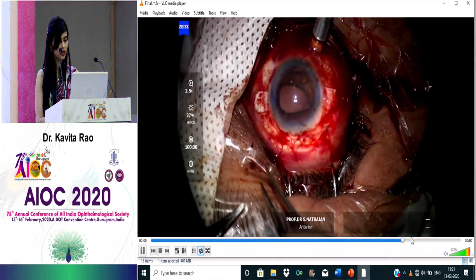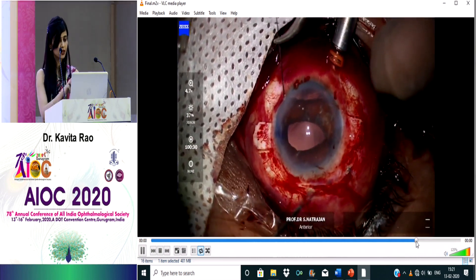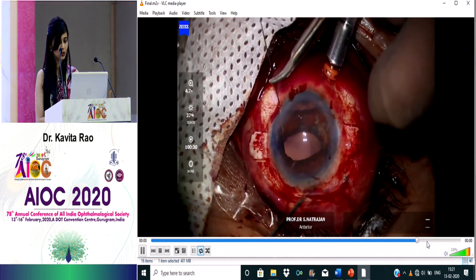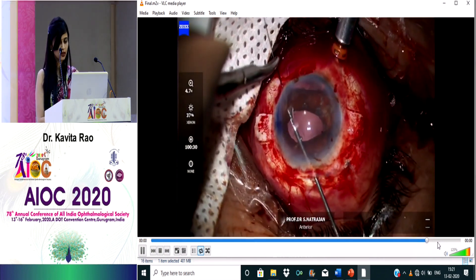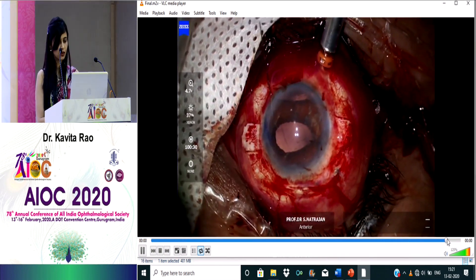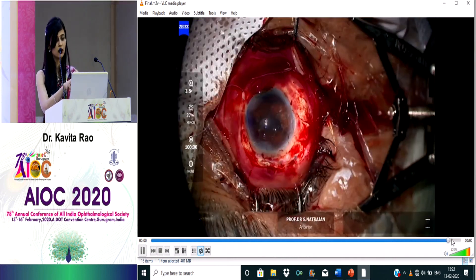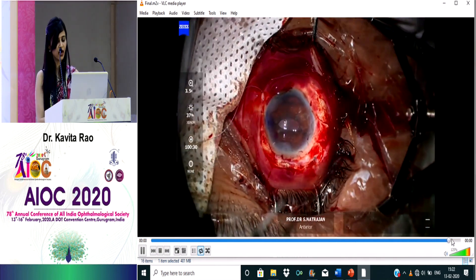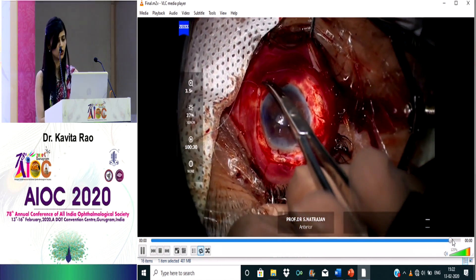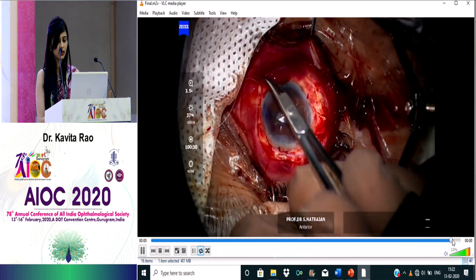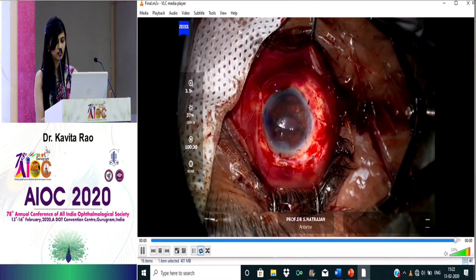The same is repeated on the other side. You can see the pupil has been sutured at one end, and here I'm grasping it at the other end — that's how it looks in the end. Ideally the peripheral iris should also be sutured using a sewing-machine-type technique. In this case there's no question that this would be the preferred technique.